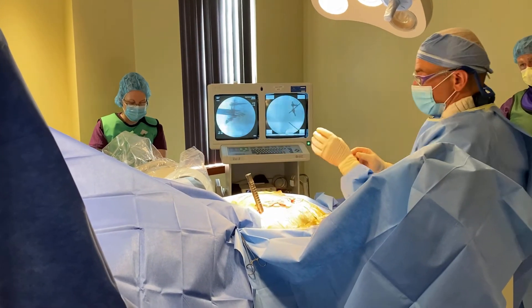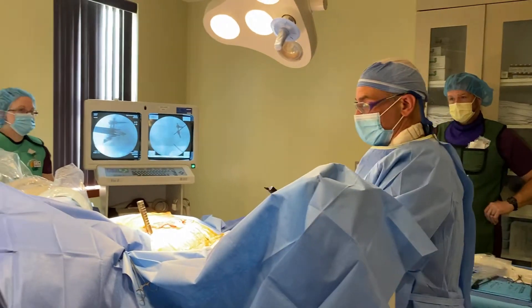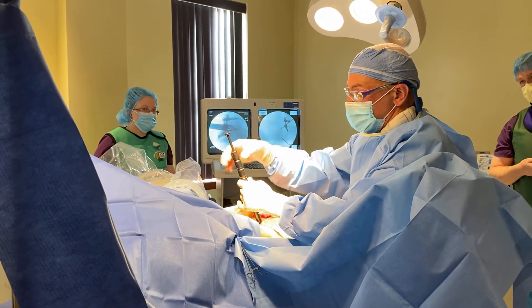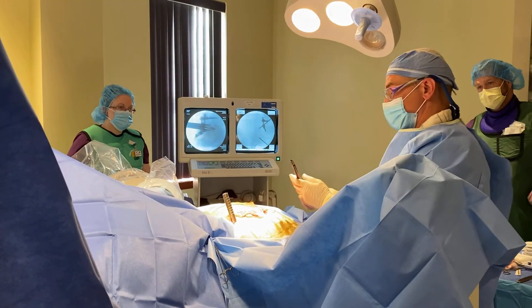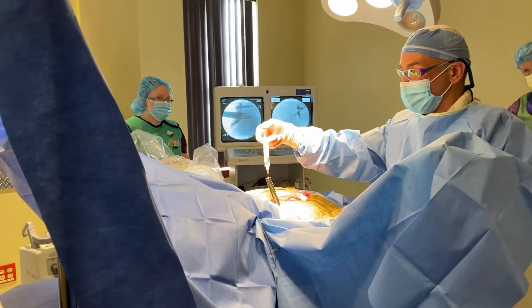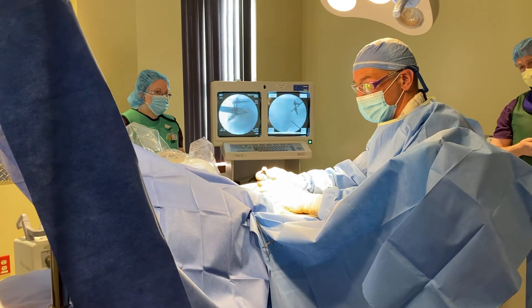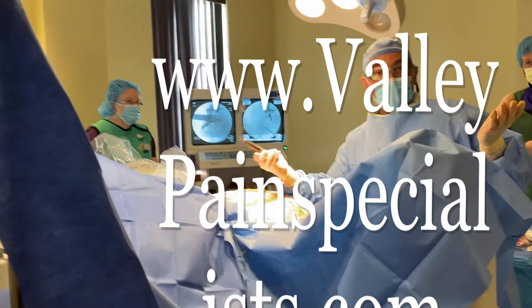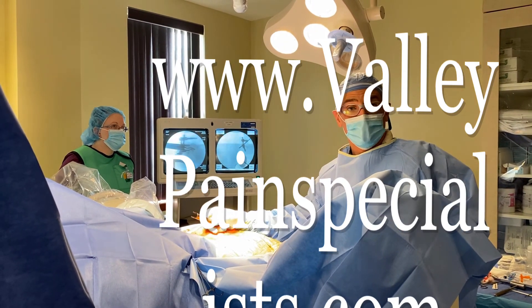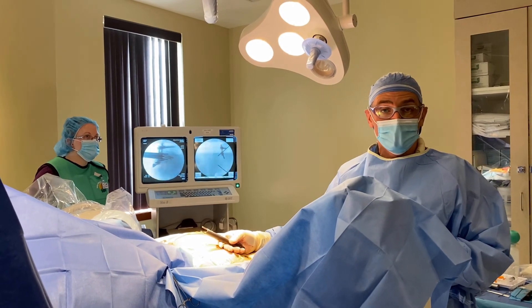Now we remove the introducer — sometimes it gets a little stuck, so there's an ingenious little device you screw in and use to remove it by reverse tapping. We can put a little anesthetic down there for post-op pain control and hemostasis. We remove everything with a gentle cephalad-caudal tilt. Two small incisions — we'll close with standard suture and some staples. The patient will be seen back in a couple of weeks for a post-op visit and may get some relief today. Visit us online at www.valleypainspecialists.com for more informational videos and questions.